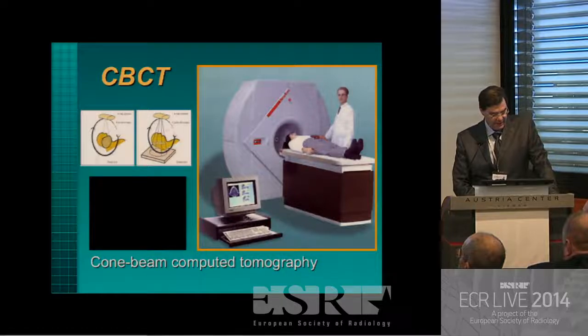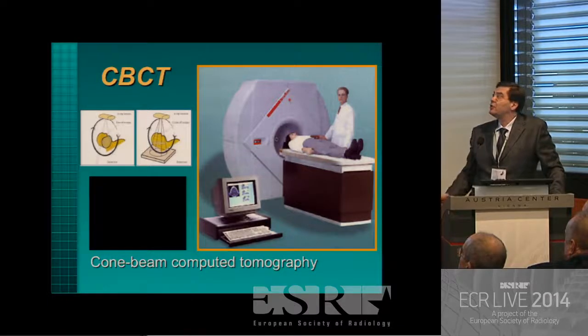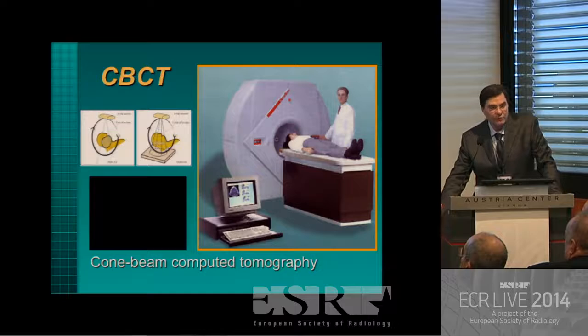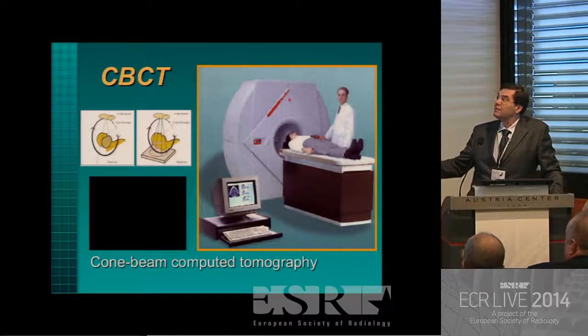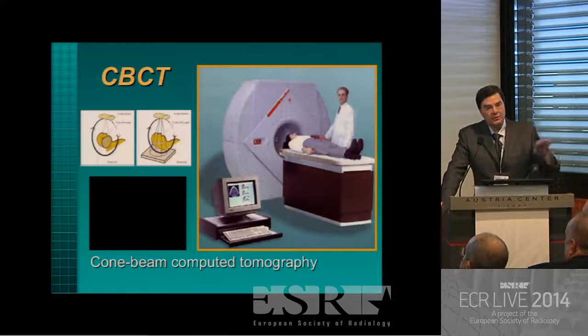I'm not going to go into the technical details, as we heard just prior to my session here. The main thing is that you can very easily see the jaw region with just one rotation of the X-ray tube around the head, while the plate which moves around the head as well makes up a complete 360 degree examination of the jaw region, and secondarily reconstructs the images.